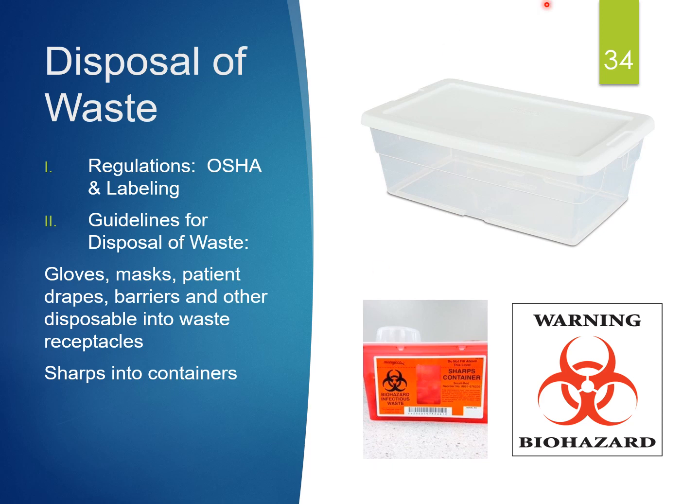Here is the plastic shoebox, and we're actually going to put a biohazard label on those for when we're transporting those to the instrument cart for sterilization.